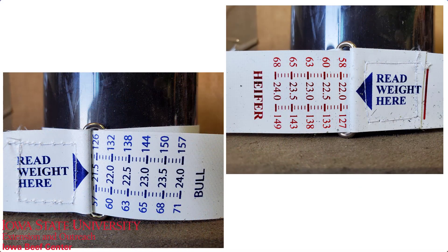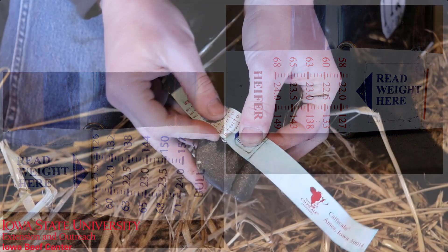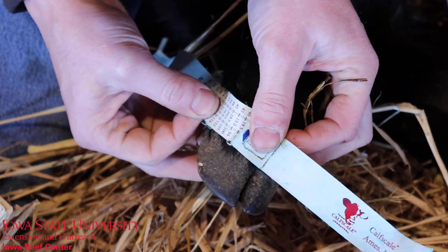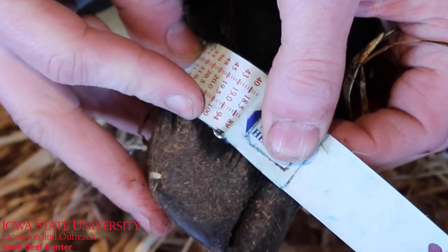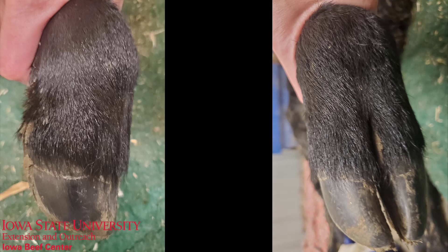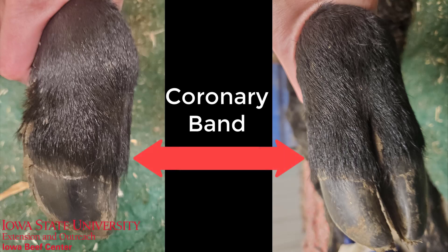On our calf scale tape we've got a bull side and a heifer side. We use the corresponding side and we take that measurement right at the coronary band. You'll see in this video the calf we're using as an example is actually a little bit older. A newborn calf within 24 hours of age — it's a little bit easier to see that distinctive line on the coronary band.